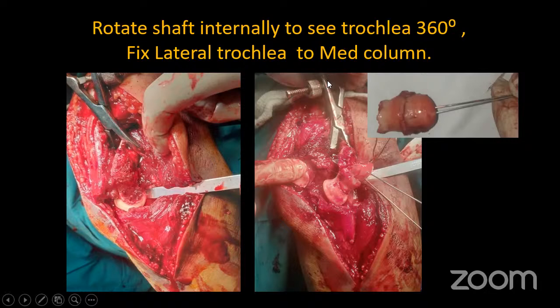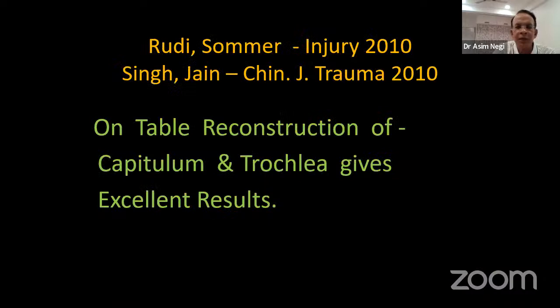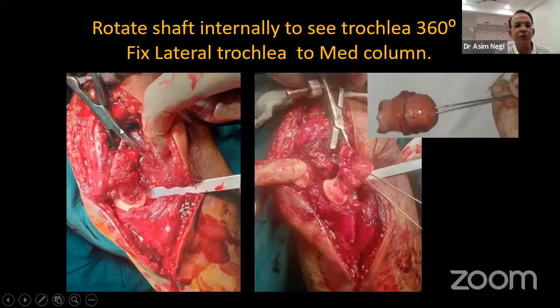Then you rotate the shaft internally to see the trochlea 360 degrees and fix the lateral part of the trochlea to the medial column. This is what we had done. We had reconstructed it on the table, brought it here, rotated the shaft. This is rotating the shaft so you can have a 360 degree view, back to lateral side to front. Complete trochlea is seen. You fit it into this, pass these K wires, and then you pass two or three more K wires to fix this lateral trochlea to the metaphysis there.